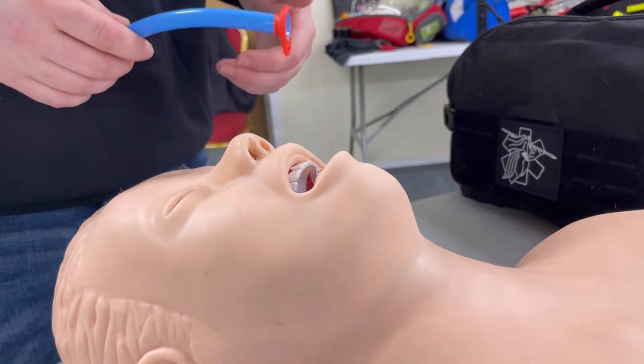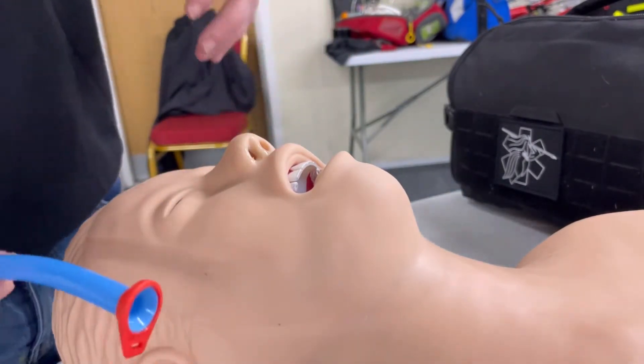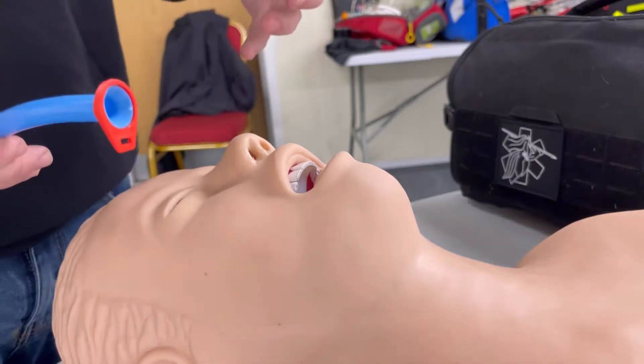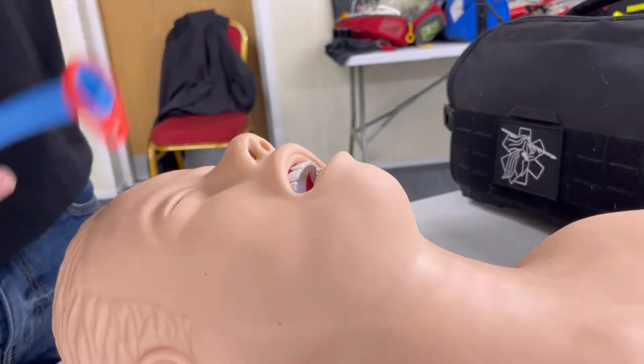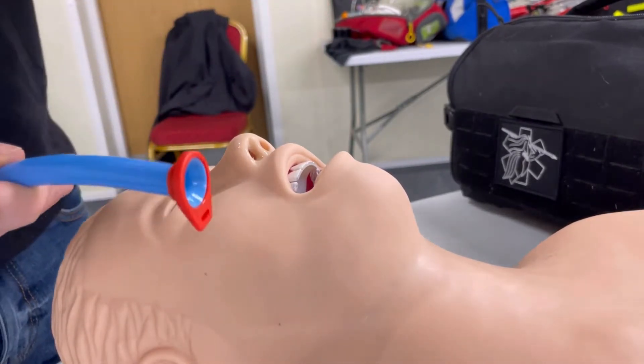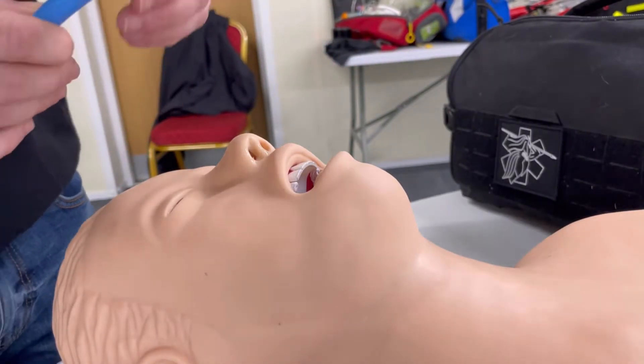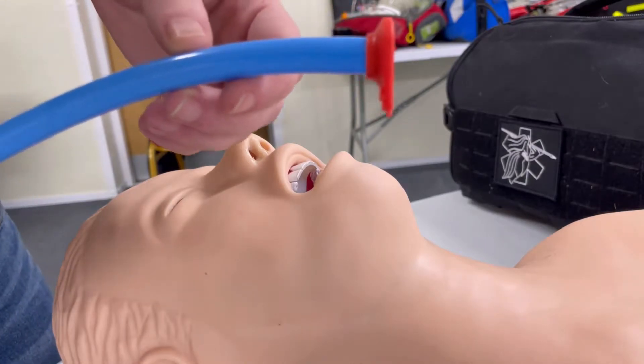Hello and welcome to Spear Medical Education. I'm Eric and today we're going to be doing another one of our skills videos. These are live demonstration videos away from our usual screencasts where we will demonstrate some practical medical skills. Today we're going to be looking at the nasopharyngeal airway, or the NPA.